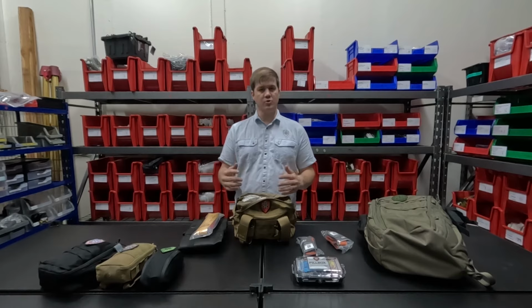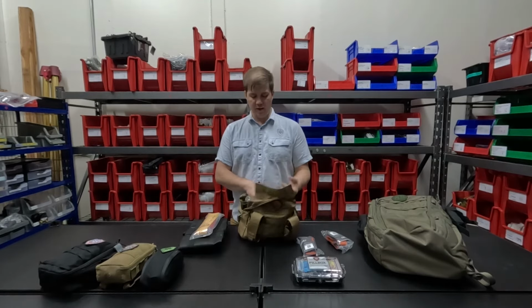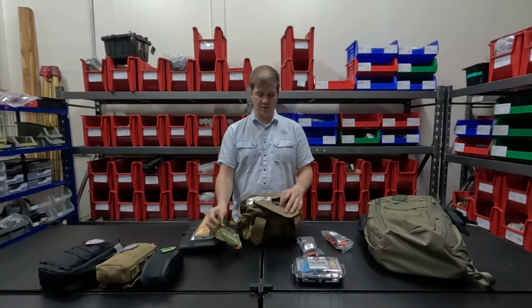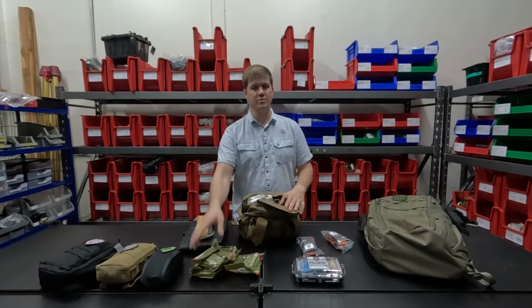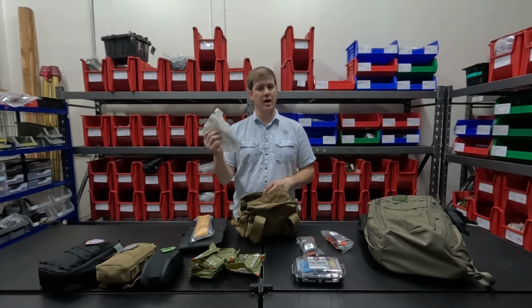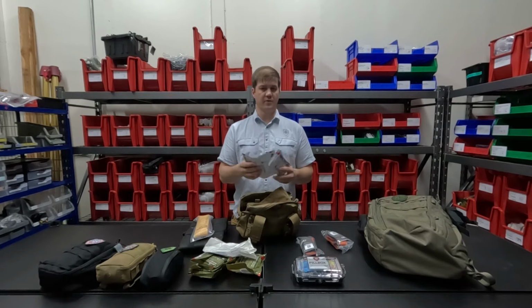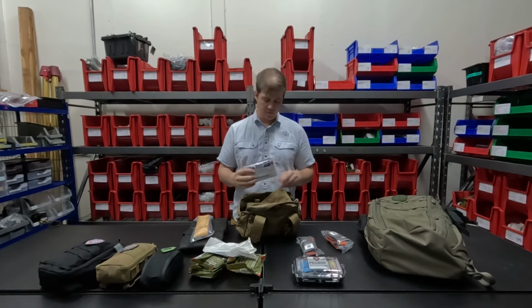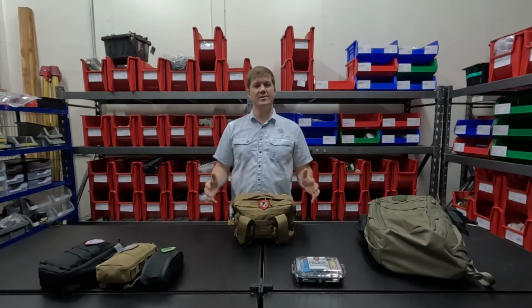After that, we've got some more treatment options. We talked about massive extremity hemorrhage being important, but if somebody needs a bandage maybe instead of just a tourniquet, we've got some bandages here in the pouch right up front. We've got 4 of those to take care of multiple injuries. Airway compromise is another concern, so we've got those here as well, along with chest seals for different patients. We've got 2 twin packs, so you'll have 4 chest seals overall to take care of multiple patients, and those are all tucked neatly in their own little pouch. So that's our active shooter bag.